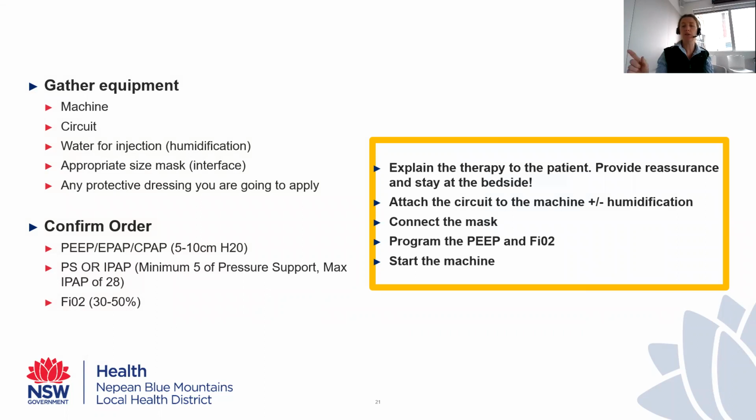And PEEP itself has consequences for hemodynamics. So it can affect blood pressure. And we just need to be mindful that maybe the patient is needing a higher level of observation or support, and they're better suited to be cared for either in a specialist respiratory ward, a specialist respiratory closed observation bed, or an intensive care unit, or somewhere like that.